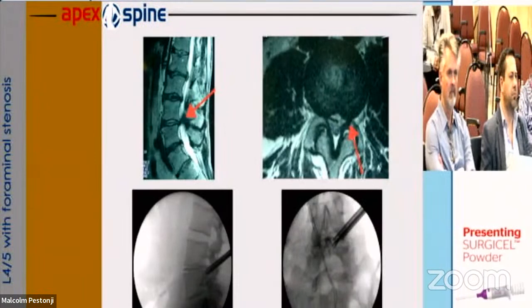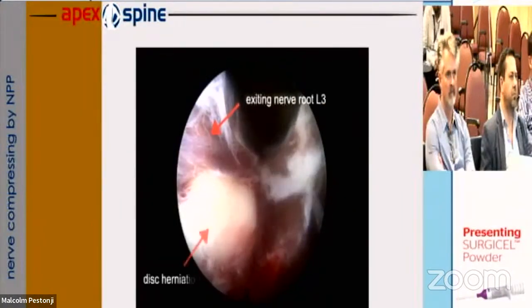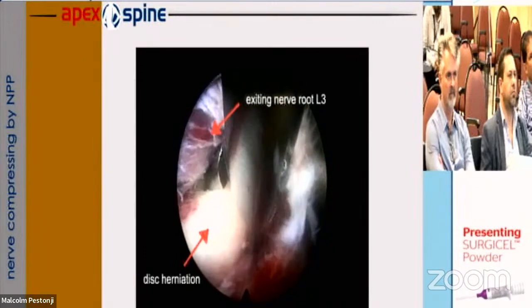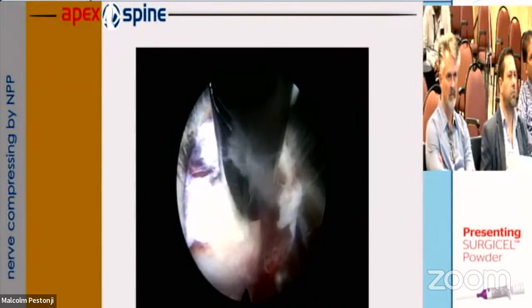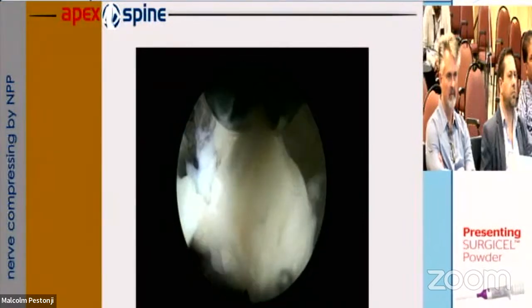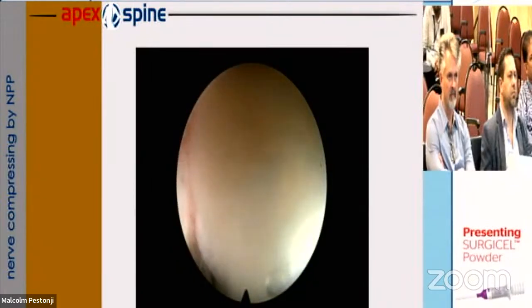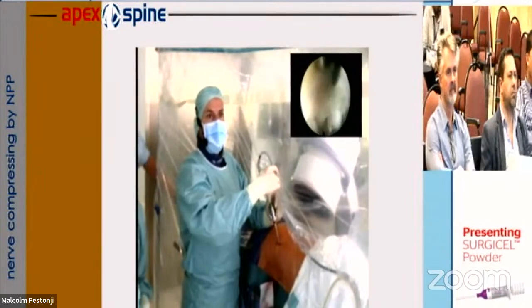Here it's a neuroforaminal stenosis. For the reason that I explained already, that we have reamers or drills, you can nicely perform foraminotomy. What you see here is an intraforaminal disc herniation. Open procedure. You just have to ream. You just go there. In this procedure, for example, I needed less than 10 minutes to be there to remove this disc herniation. And at that time, a colleague from the Netherlands was with me, and I removed the disc herniation. It was a very big one.